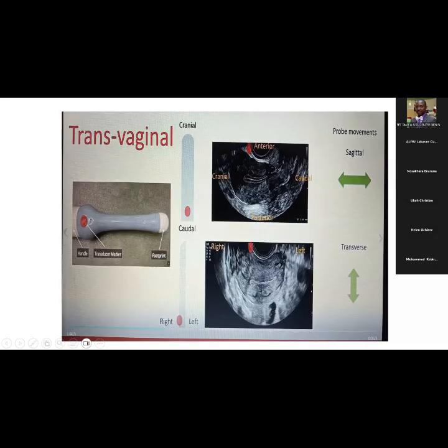It's always important. So by the time you change the scanning plane and you get a coronal view, this will be right because again, the marker suggests that you should always place it to the right, and then the other side will be the left. So when you make your movements, the movement for this plane that is sagittal should be, like we said before, side to side, whereas the movement for the plane that is coronal should be up and down to be able to fan through and see the details.